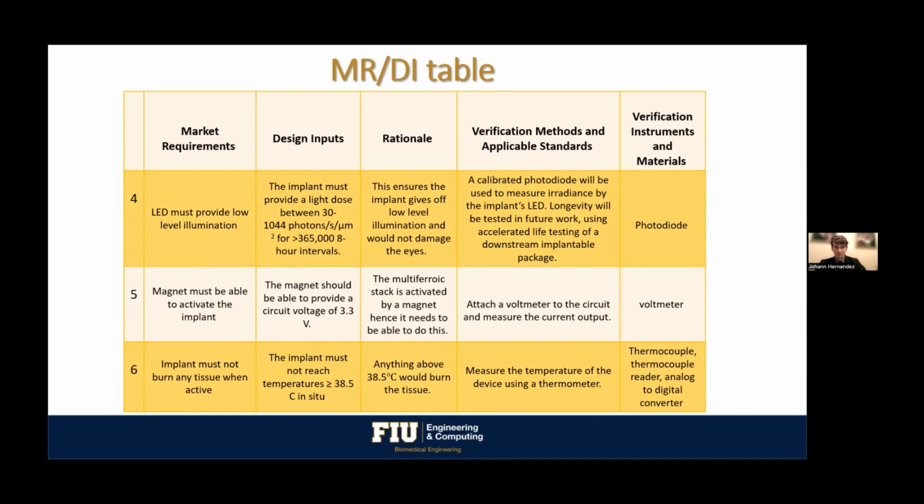Marker requirement in design input number 6 is that the implant must not reach temperatures above 38.5 degrees Celsius in situ, which is 1 degree above homeostatic body temperature, to avoid burning any surrounding tissue.